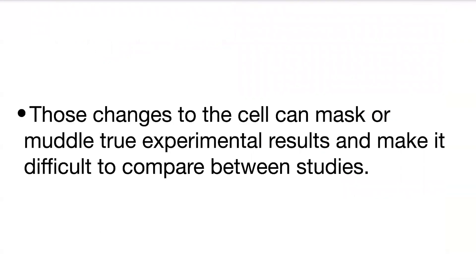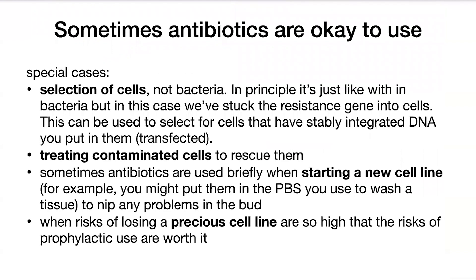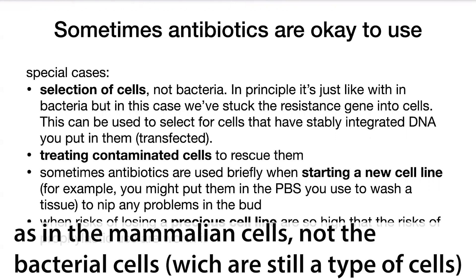When we're talking about prophylactic use, we want to avoid that for mammalian cell culture for the most part. But there are times when it's okay to use antibiotics. One of these cases is in the selection of cells — and here we're talking about the selection of mammalian cells, not bacteria.